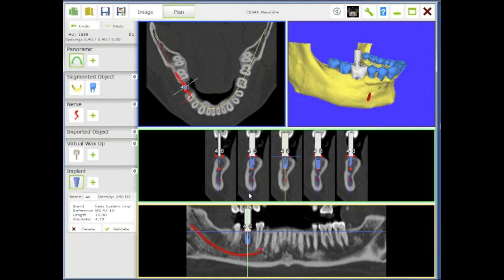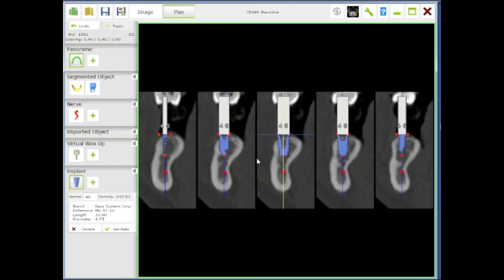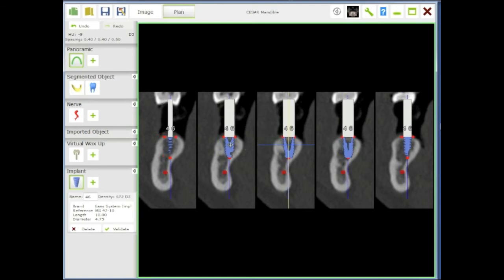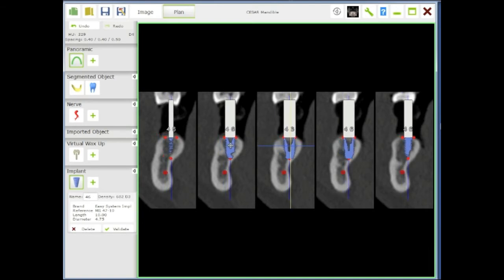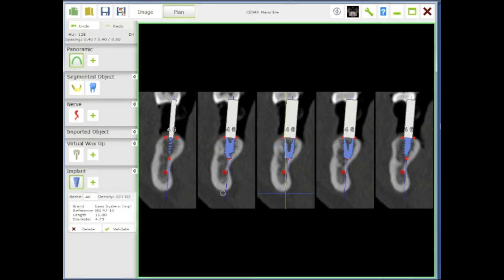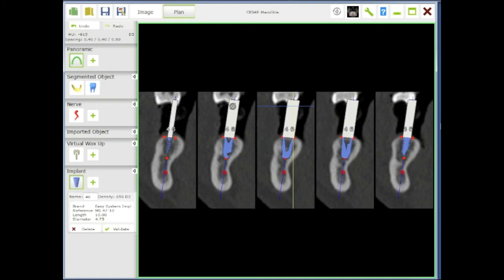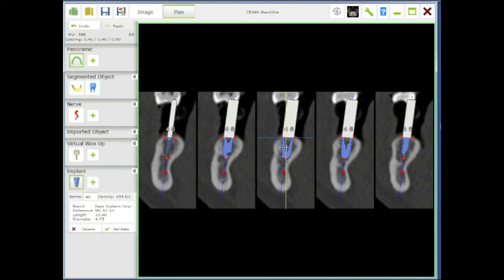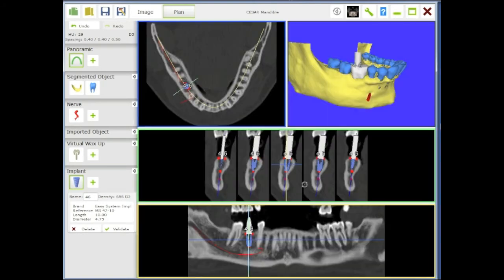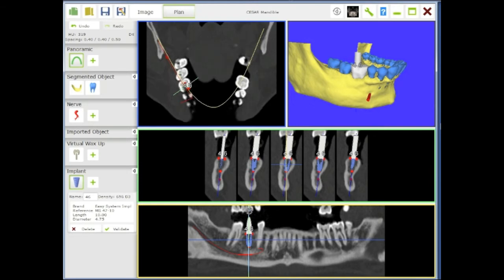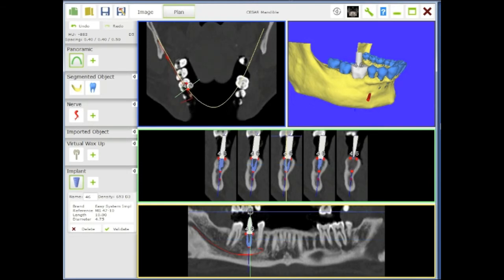To do that, I'm going to show you in full how we do it. You go across the implant, you can move it around. If you go to the bottom, then you can rotate the implant from the top or from the bottom, and then placing that, you know if you're going to work at the level of the bone or supra osseous level. You select that, you click here, and you have your implant.